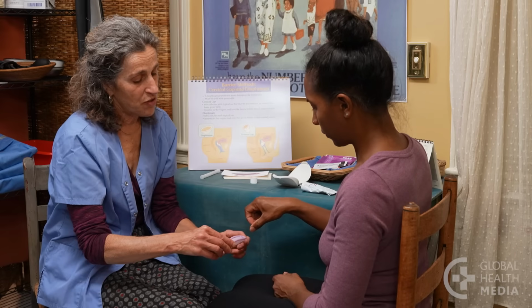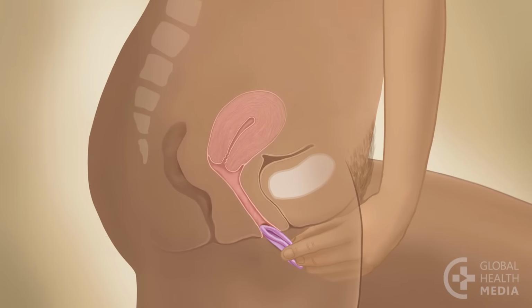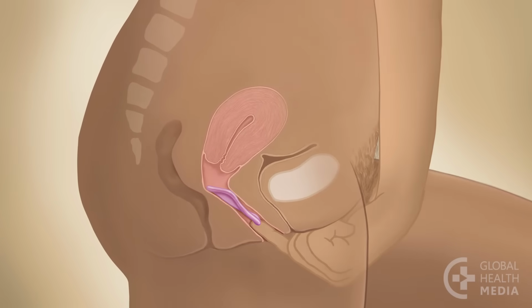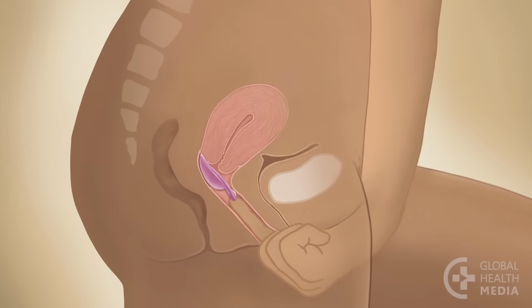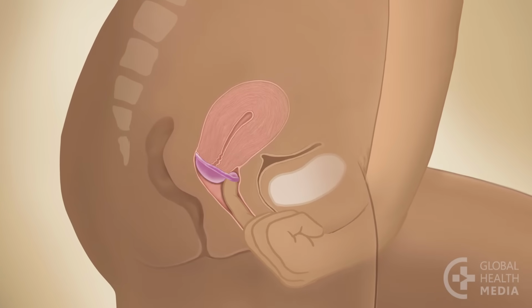Now, put your diaphragm inside. Separate the lips of your vagina, then pinch the diaphragm so it's long and narrow. Insert it with the rim end first, in the direction of your tailbone. It should slide in soft and easy. Push it all the way in, as far as your finger can reach. Then push the front edge up and tuck it behind your pubic bone.